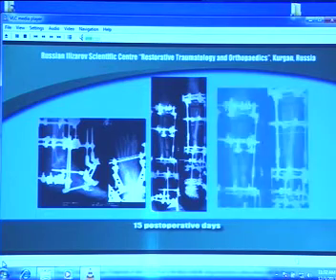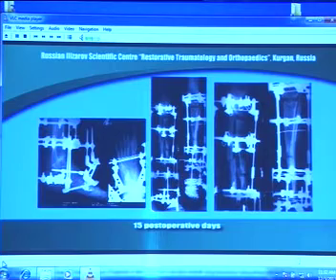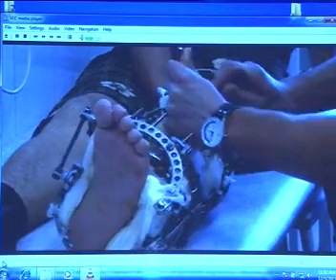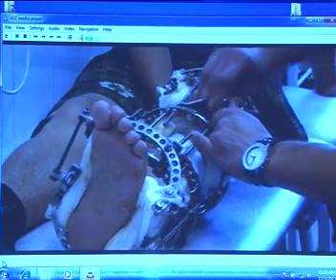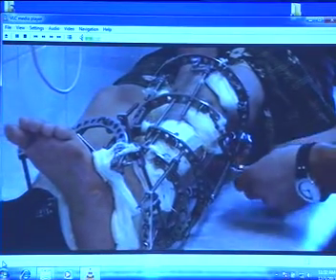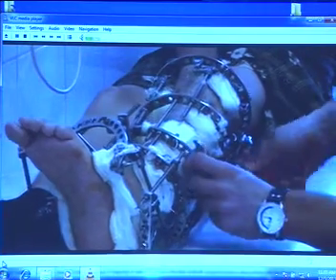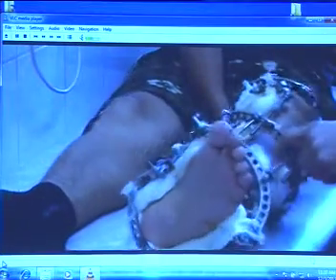After 10 days of distraction, the limb axis is well realigned. A diastasis of 1 cm formed in the upper third of the tibia at the level of osteotomy. Bone transport commenced on postoperative day 5 to 7 at a rate of 1 mm per day over 3 to 4 fractions, depending on the quality of the distractional regenerate bone. Foot deformity correction was produced during 10 days using hinges in combination with bone transport further on.